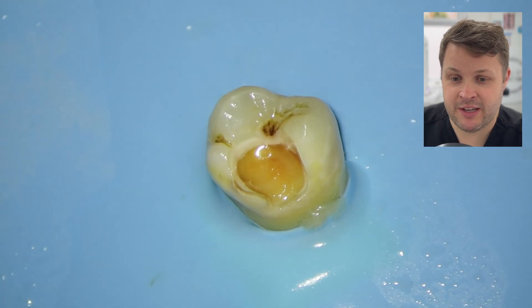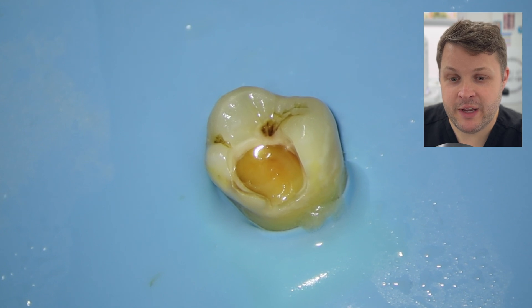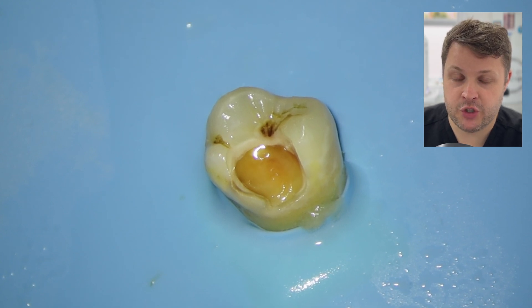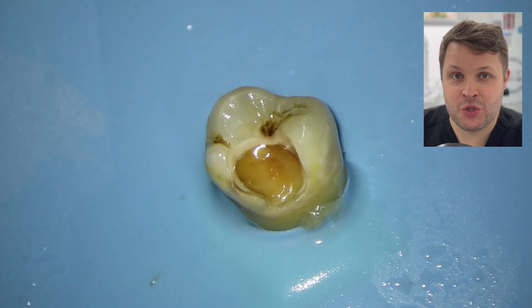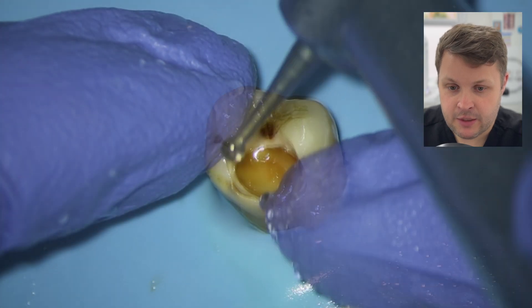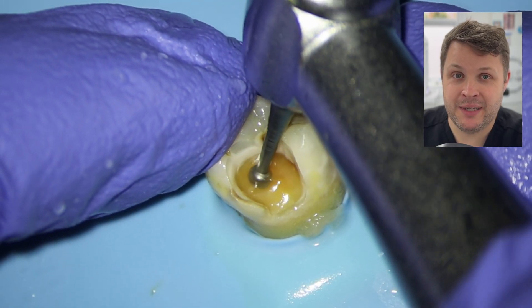Another reason why I don't want to use the fast handpiece with the sort of soft tooth tissue underneath is that I want to try and preserve as much of the tooth tissue as possible. With the fast handpiece, that's going to take away tooth tissue really, really easily. So what I am going to use is a slow handpiece.